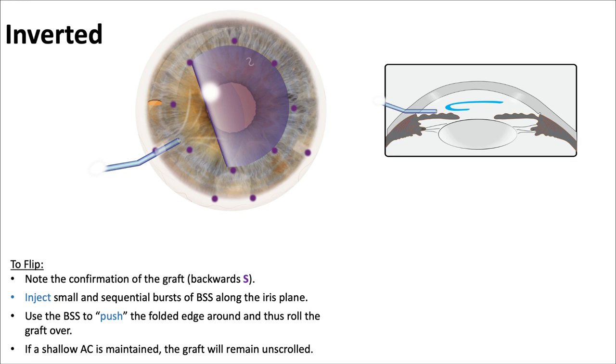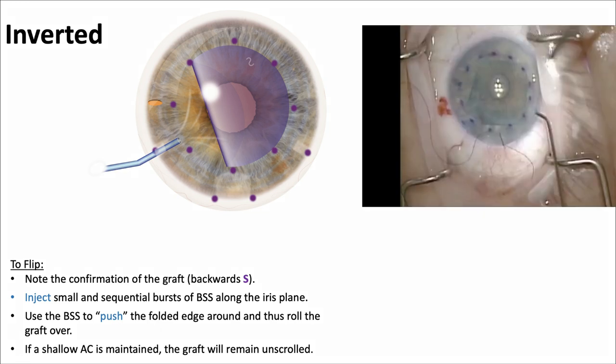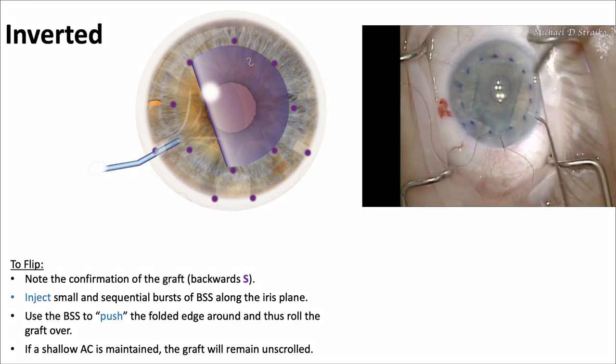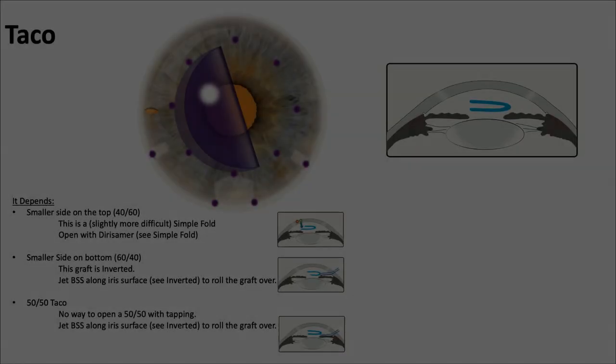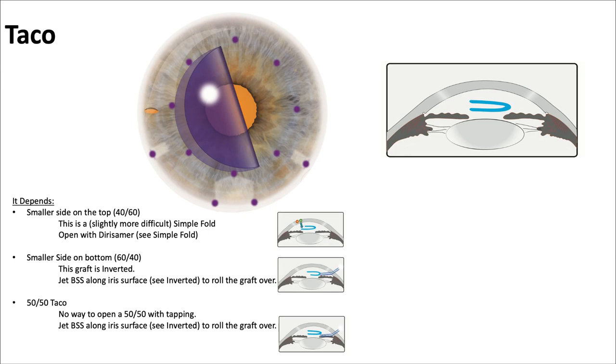Inverted: you have to inject a small amount of BSS in little bursts along the iris plane, and that'll help flip it over. If you maintain a shallow anterior chamber, the graft remains unscrolled — so don't let the AC pressure build up. Here you see it's upside down, and a little bit of injection of fluid flips it right over.